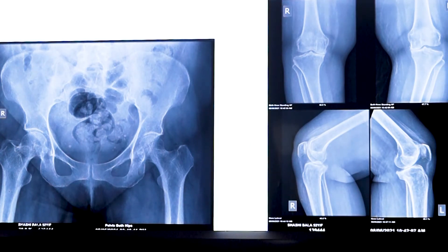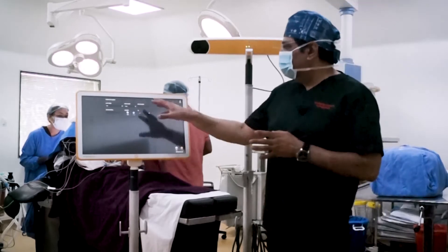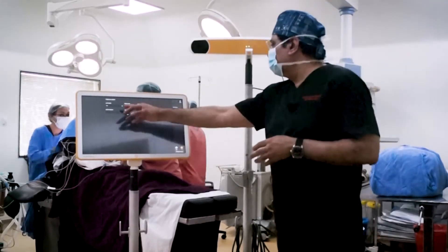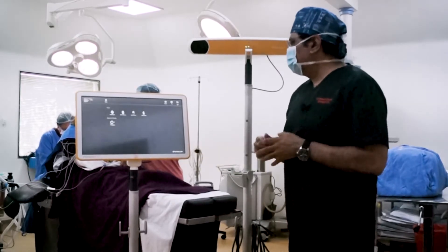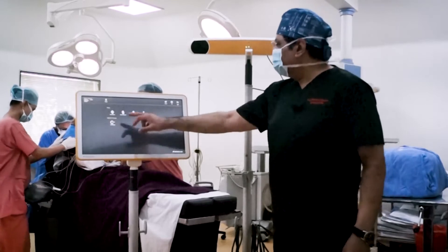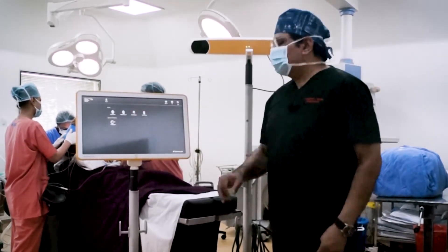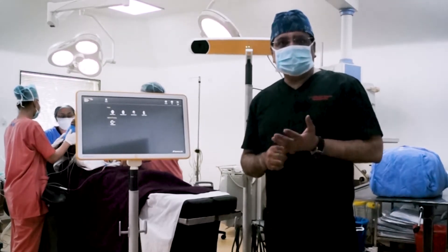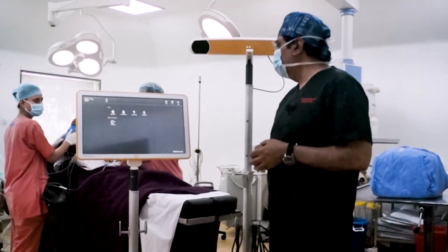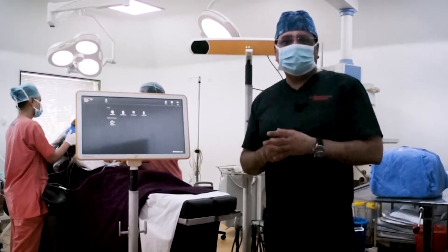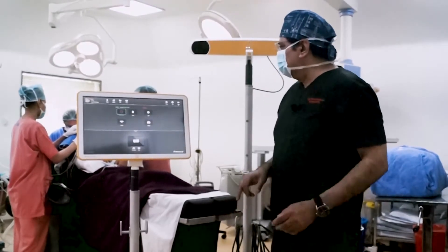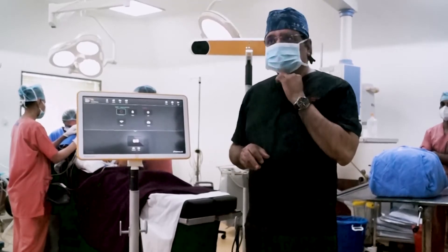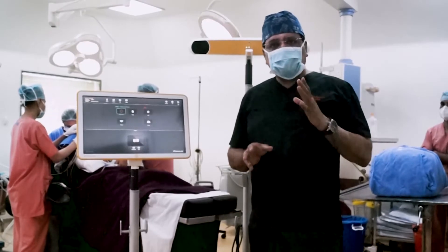We will show you the various setup of the computer and how we perform this surgery. The first step is to enter the details of the patient, like name and hospital number, then click done. After that, you get various options: Knee 3 Motion Universal means you are using any implant other than Johnson & Johnson; Knee 3 Partial means you are doing a half knee replacement by Johnson & Johnson. We are now selecting Knee 3 Motion, which means we are doing a knee replacement using a Johnson & Johnson implant.